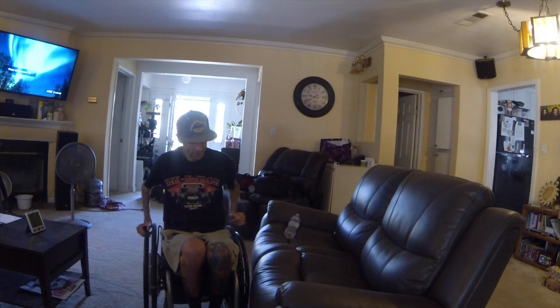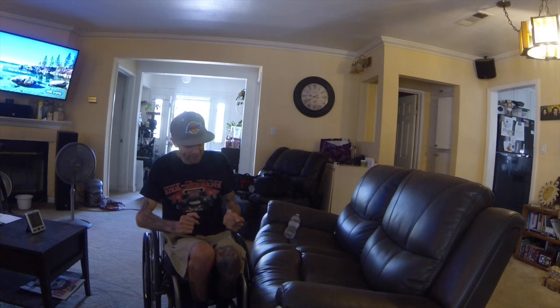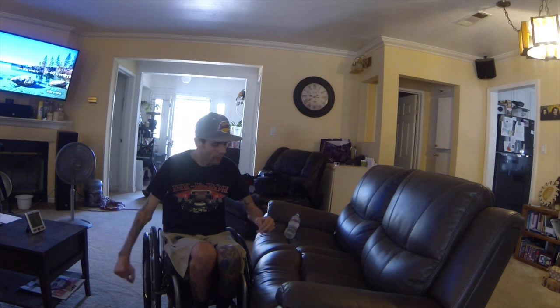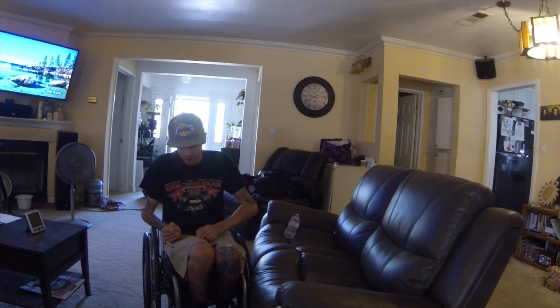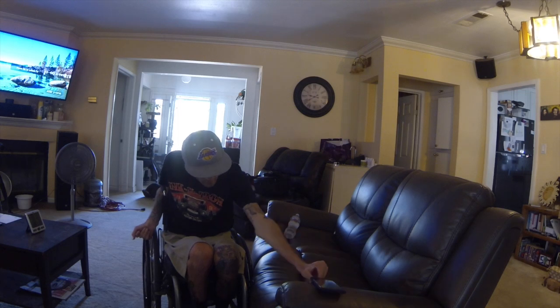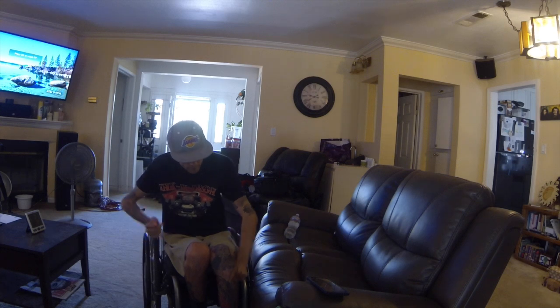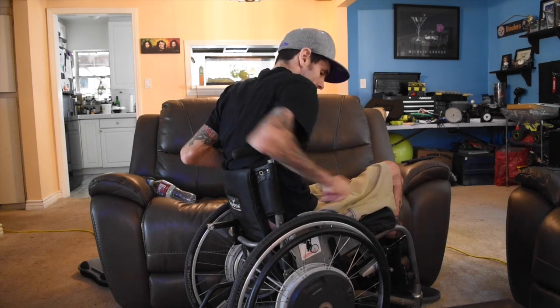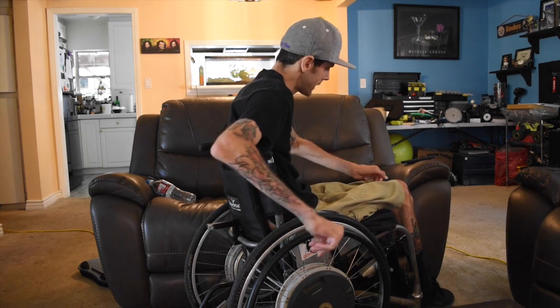So for my transfer, I always pull up at a nice angle where I get contact with the front of my push wheel and the front of my bottom caster, whichever way I'm leading for my transfer. I'll set the phone right there. The first thing I do is pop my feet off. When I do that, I usually hold on to my little push bars back here. I use those for everything. It's just natural; my arm just goes back there.